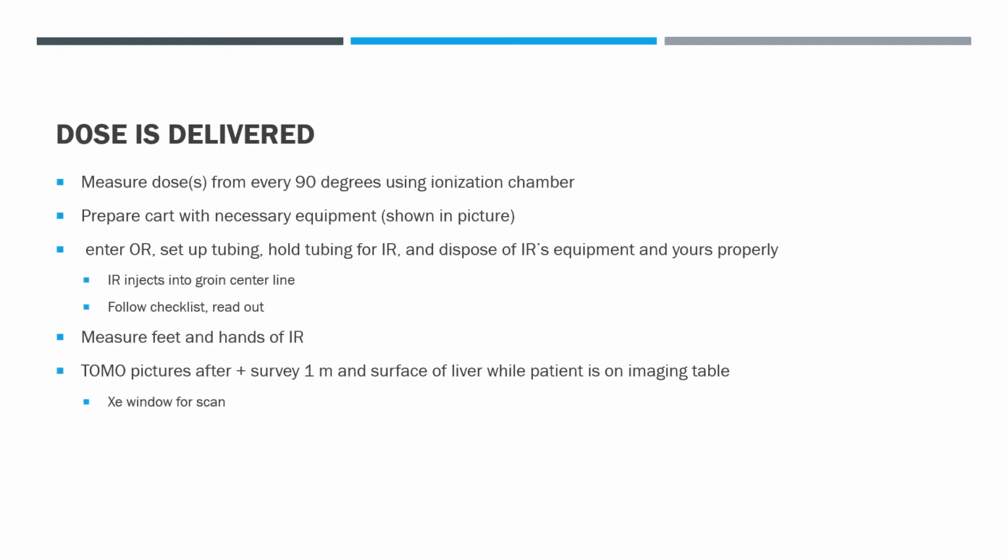Okay, so now we get to the point after we determine what the dose is going to be, and we have Cardinal deliver the dose to us after looking at the therapy order form. And it's kind of interesting when they brought it, because it's a very high dosage, because the Theraspheres, the microspheres, they emit beta emissions. So you have to be really careful.